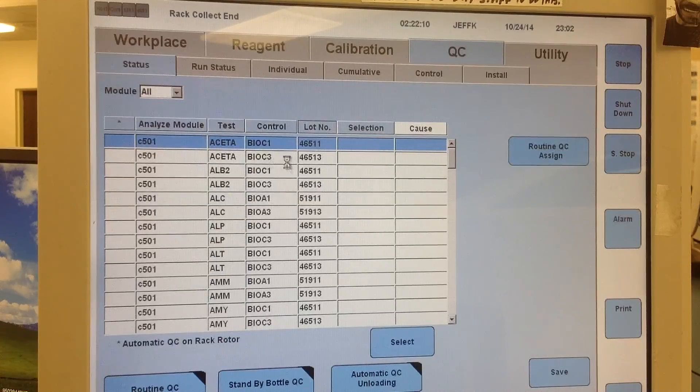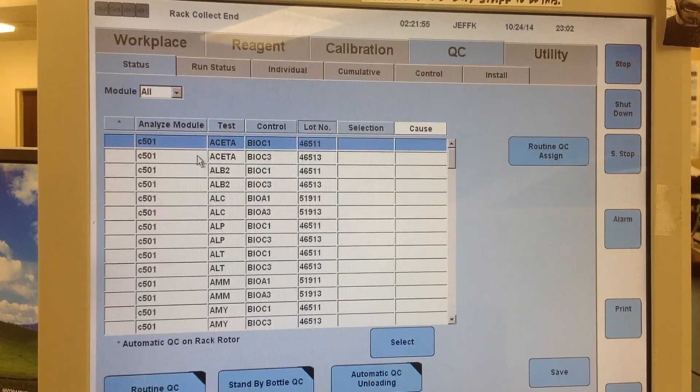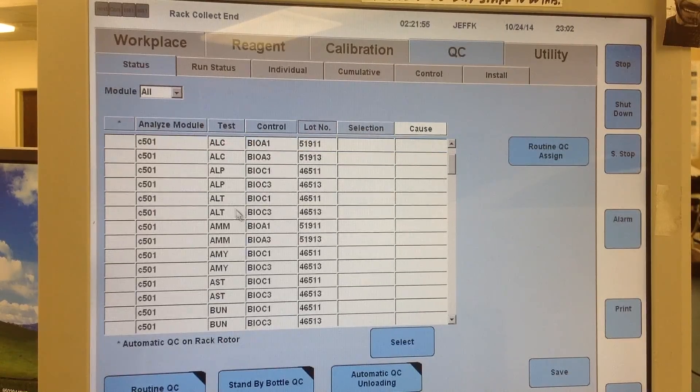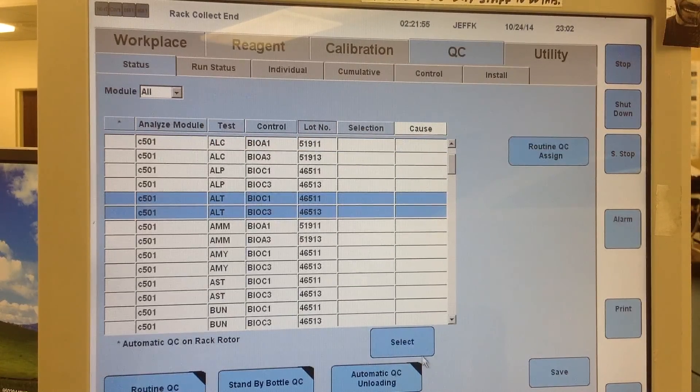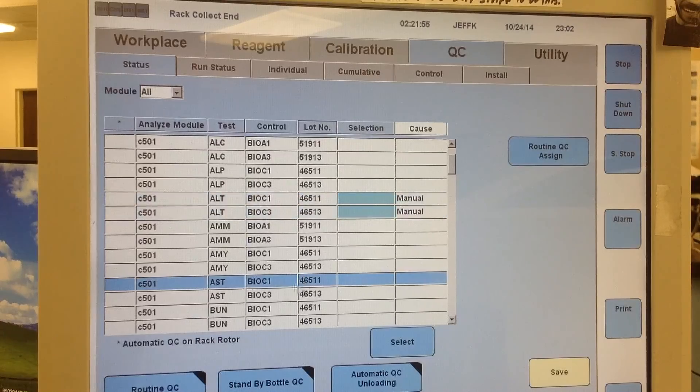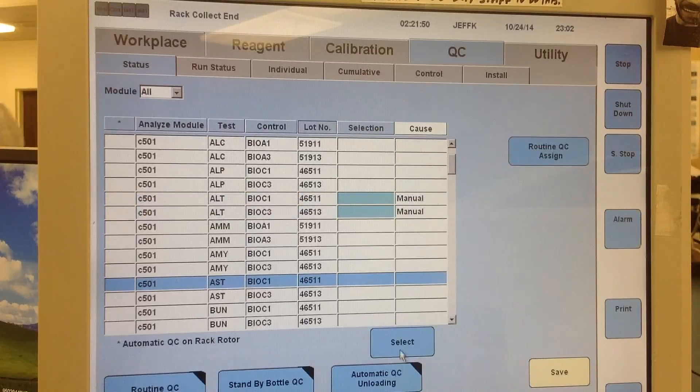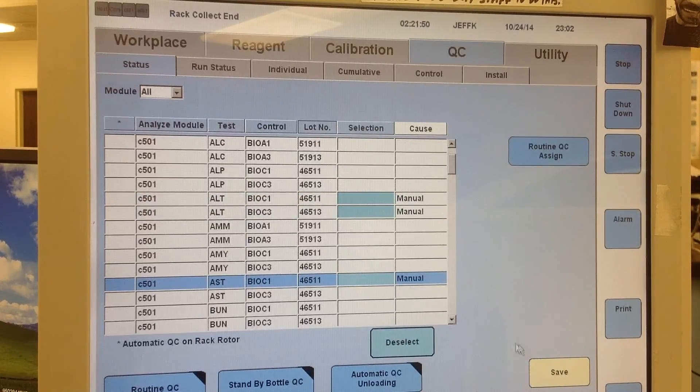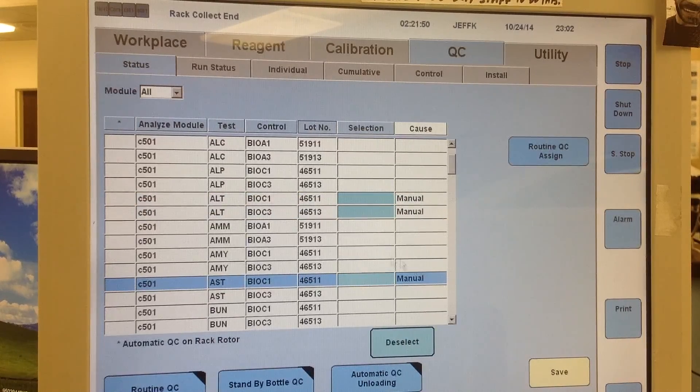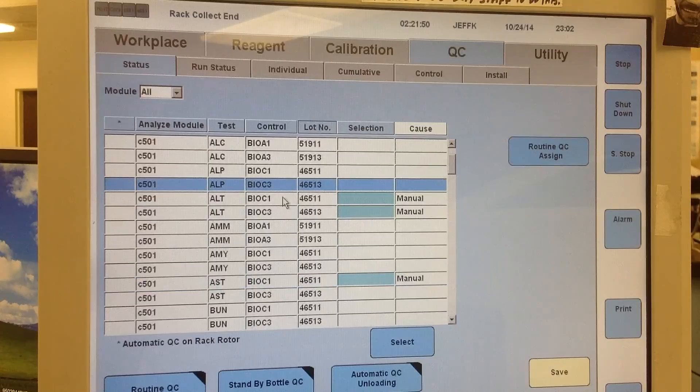So that's how you can go about ordering individual tests. You can highlight several tests and select them all at once, and then click another test and select that one. And then just always make sure that you save whatever you've ordered.